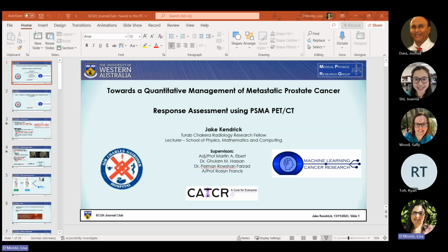So this is a particularly low disease burden metastatic prostate cancer cohort, which is important because this particular response assessment framework had only been validated in very high disease burden patients, specifically castration resistance, which you just heard about previously. So we followed these patients up from the time of their second scan to facilitate the survival analysis we wanted to conduct. And in the interim period between their baseline and follow-up scans, they received standard of care treatments. So this can include surveillance of the disease, so no treatment but actively surveilling it, androgen deprivation therapy, radiotherapy, or chemotherapy.